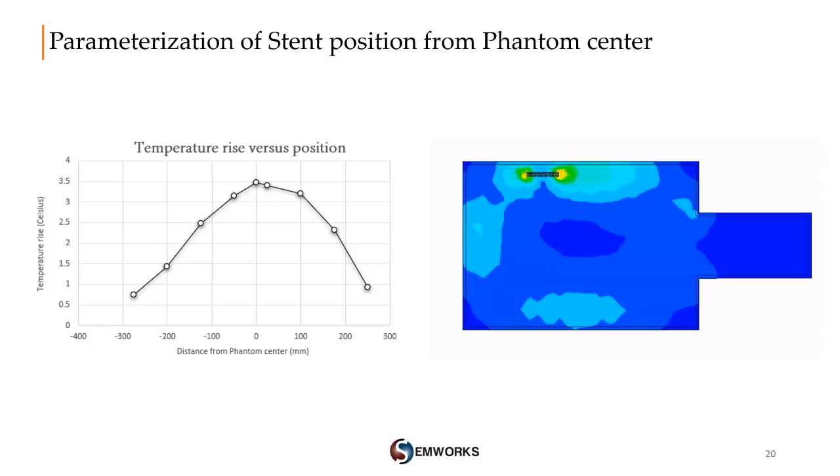In the left figure, we can see the maximum achieved temperature rise versus distance after 15 minutes of RF exposure. It is clearly noticed that the highest heat rates are obtained when the implant is positioned at the center. The right figure is an animation of the 3D plot of temperature distribution versus the different studied positions. This is another important factor that also affects the amount of RF heating inside the human body.